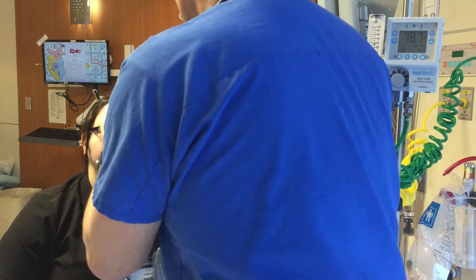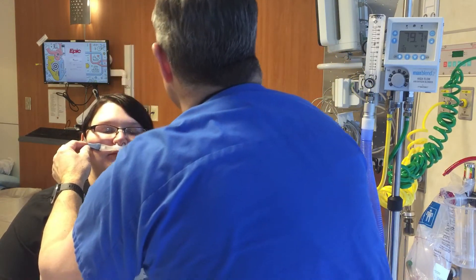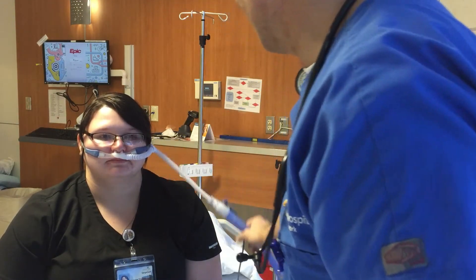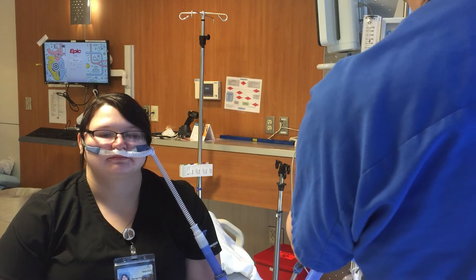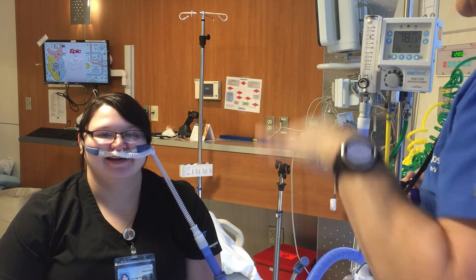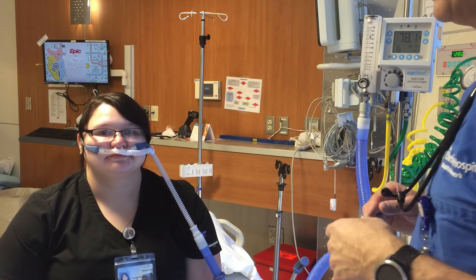We're going to put this over her head and in her nose. She's on a flow of 30, which is not a whole lot. We're going to crank the flow up to 50 liters. Is that a lot of flow? Yeah. Can you feel it coming out your mouth? Close your mouth — you feel the pressure building up in there? So that's what we want. That is how we apply it to a patient.